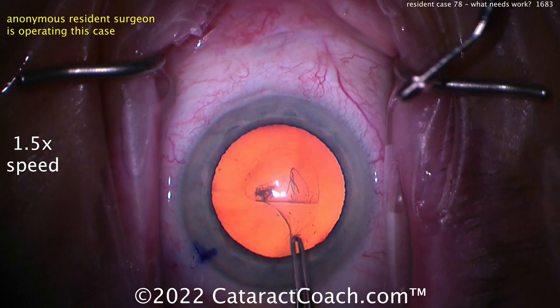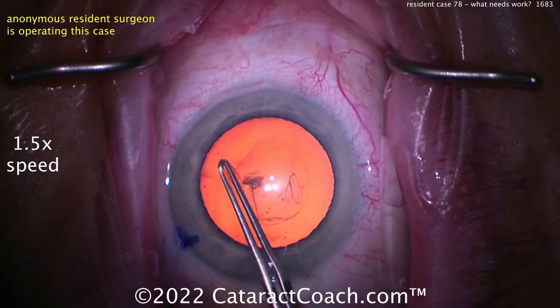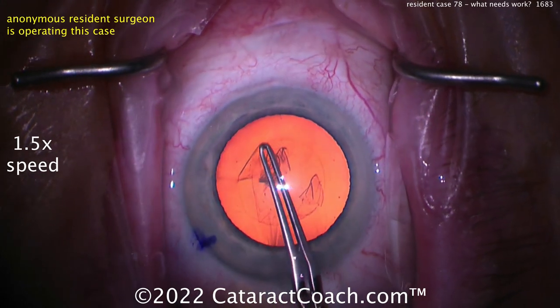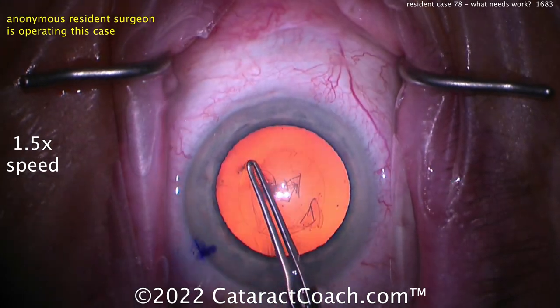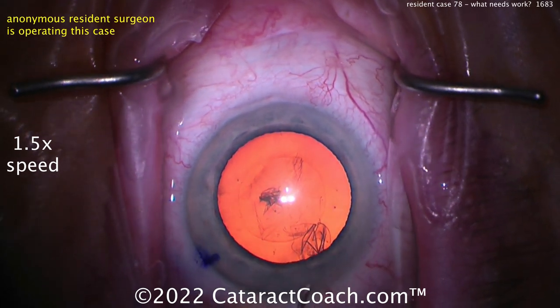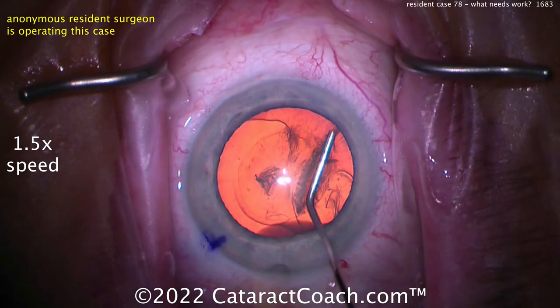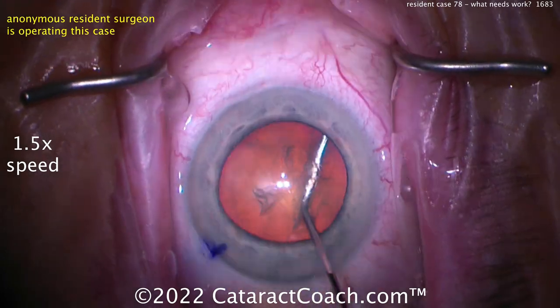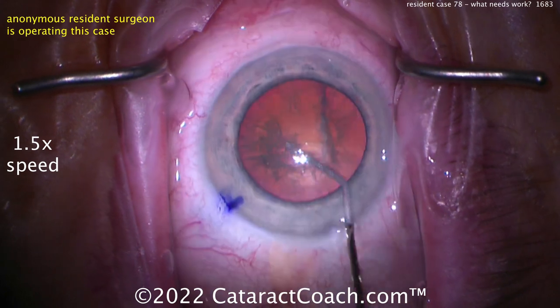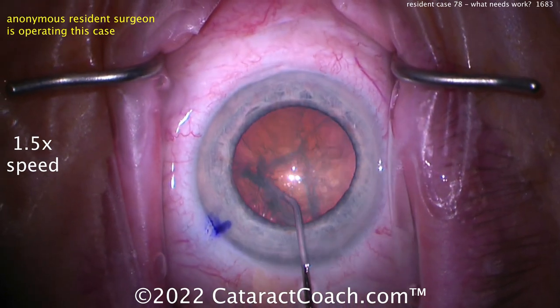Wow, really really nice technique here. You know, this new generation of young surgeons — growing up playing video games, there are studies showing that in surgical fields, those who play video games are actually better at surgery; that hand-eye coordination really is better. Looks like a pretty good rhexis, maybe five millimeters or so. Hydro-dissection, one meridian going to the other side, getting it to rotate already — wow, fantastic.